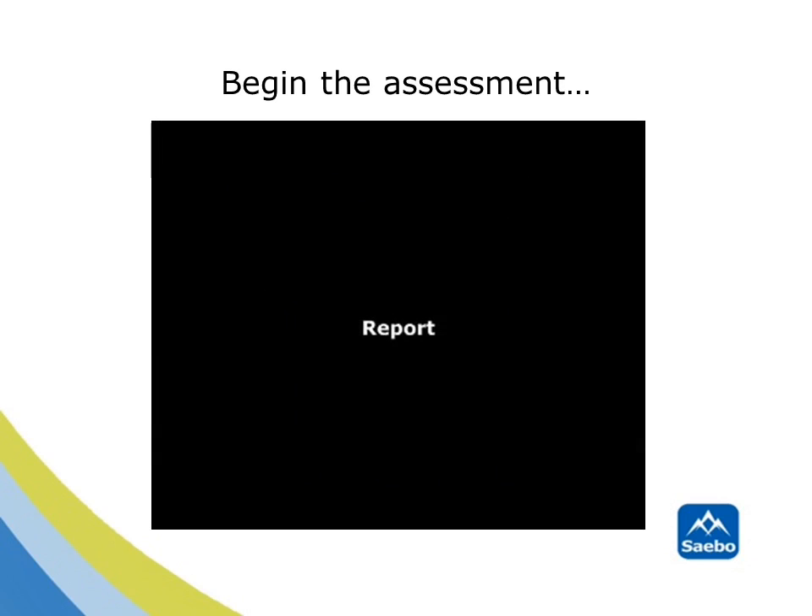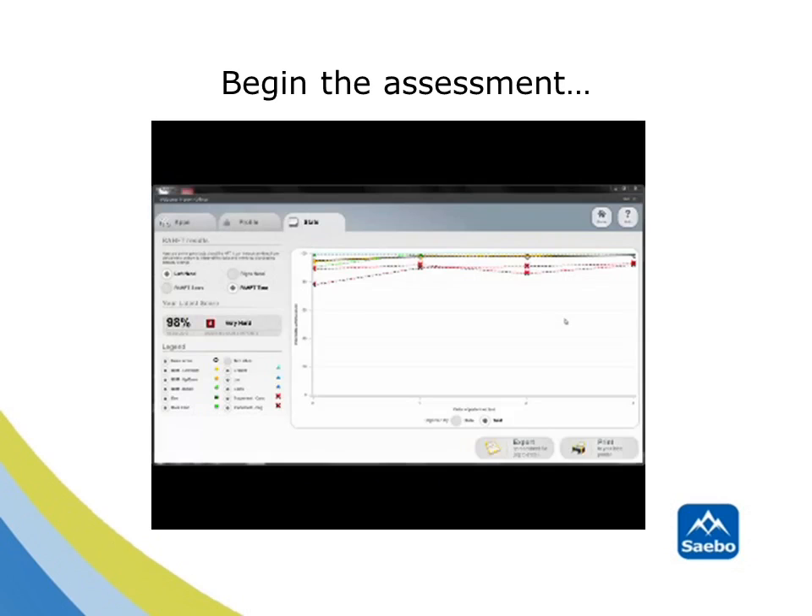A report will be generated after each activity, assessed for speed, accuracy and range of motion. Once the assessment is completed, a report is generated showing all the performance results. Each task is time-stamped and recorded for ongoing monitoring.